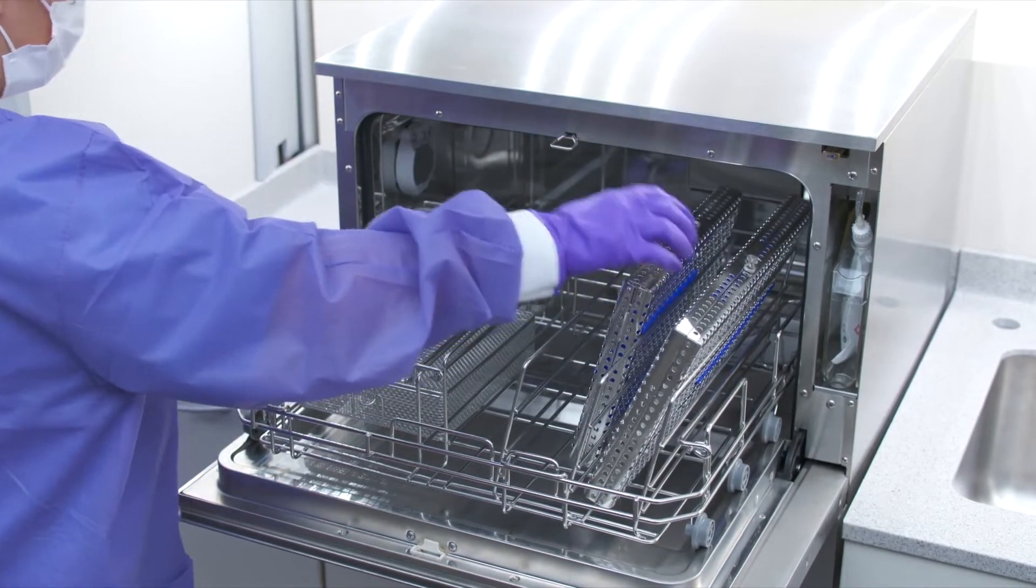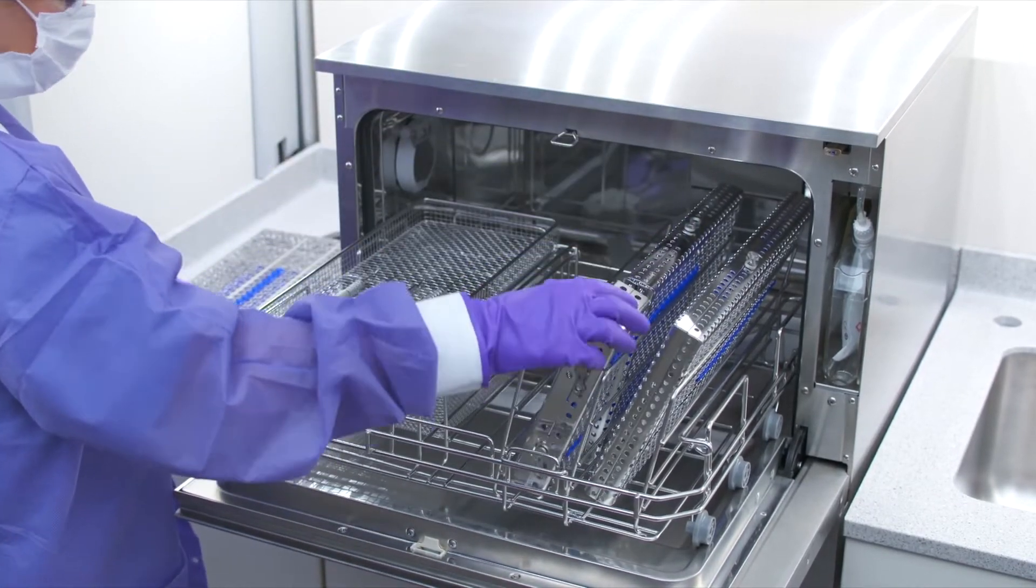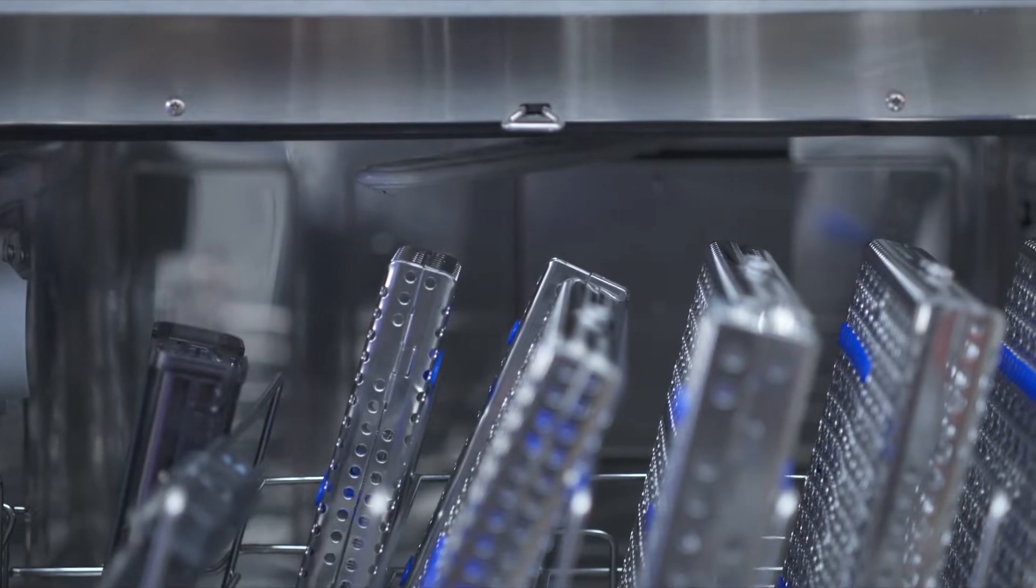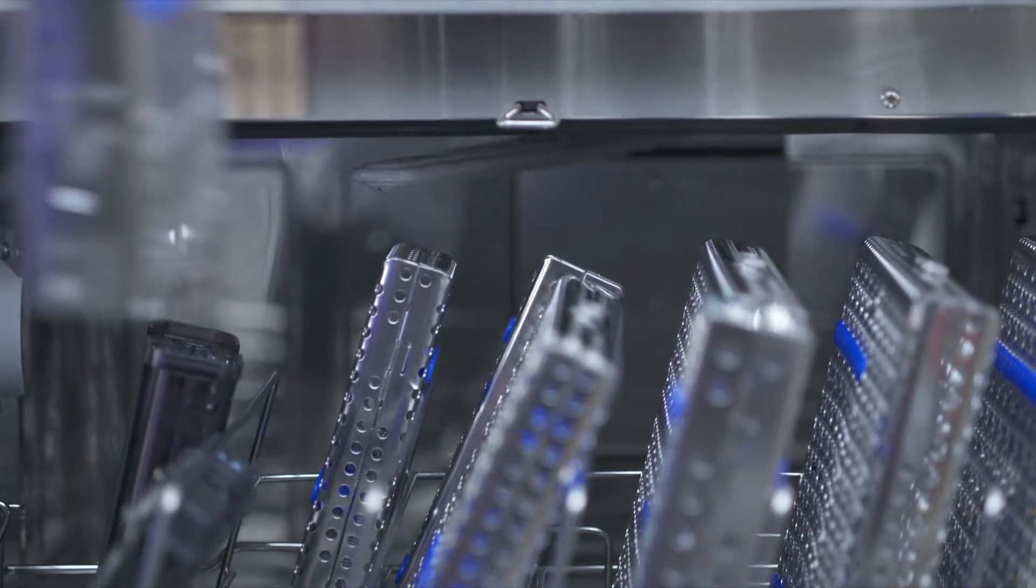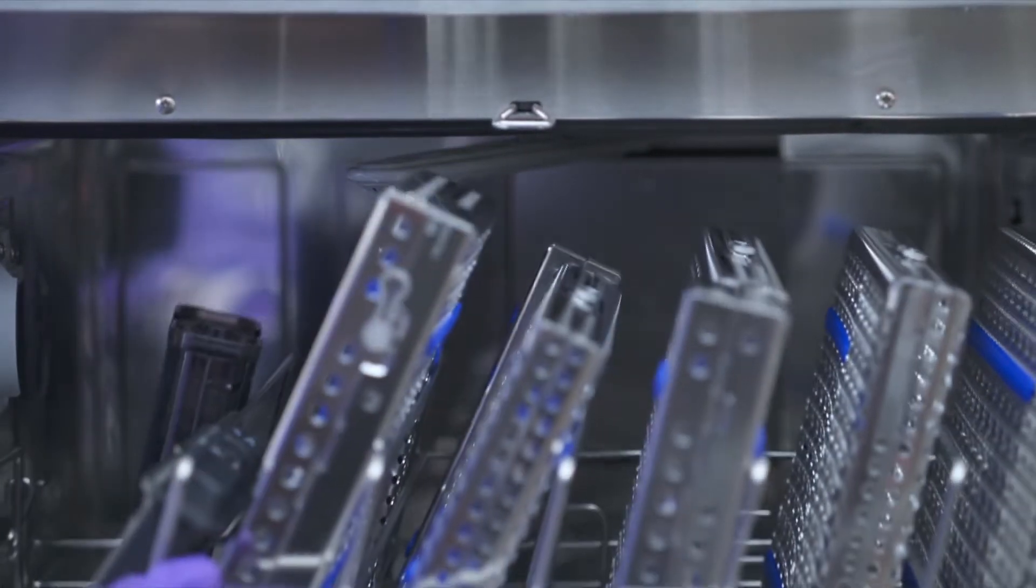Never place cassettes flat in the loose instruments area. When placing cassettes in the Hydrum, make sure that they do not block the wash arms.